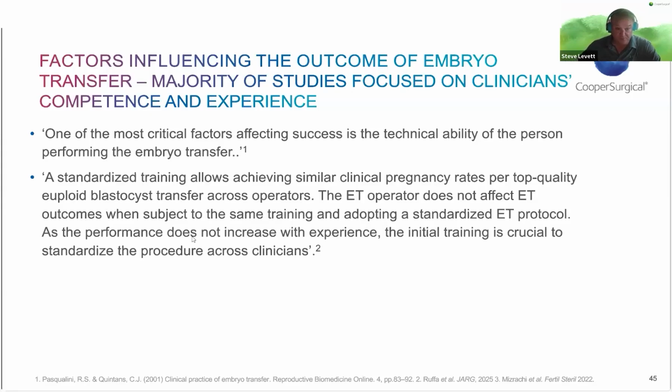As the performance does not increase with experience, the initial training is crucial to standardize the procedure across clinicians. So if you start your training and you don't use an optimal technique, using that suboptimal technique lots and lots of times is not going to increase your success. So the training at the beginning is one of the crucial factors here.